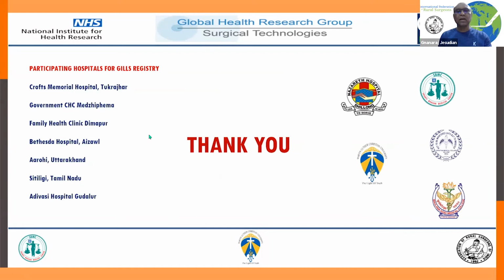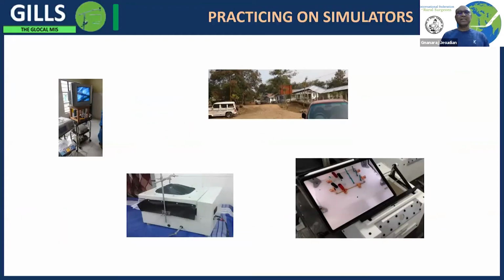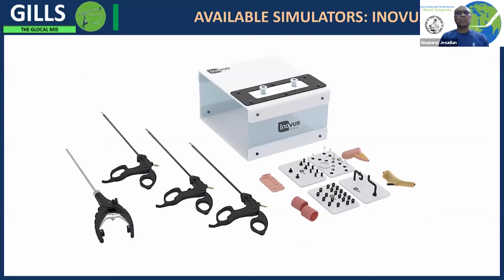Now we'll just have a quick look at the simulators that we use for training in gasless surgeries, because it's important to learn how to convert 2D images to 3D actions before we actually start working on patients. In big centers with a huge turnover, there is a possibility of learning all this in real time and on patients. But in rural areas with low turnover, you need to practice these skills much earlier so that you're comfortable to do the surgeries.